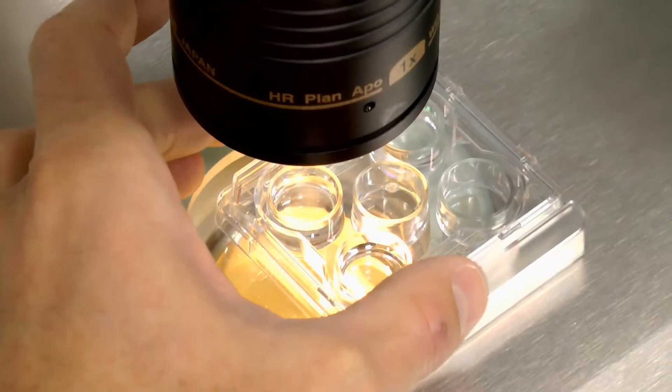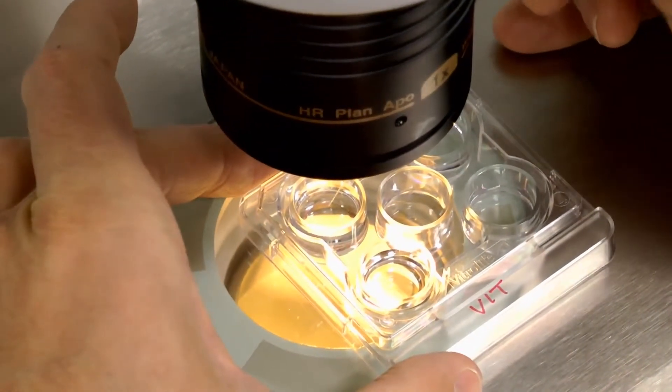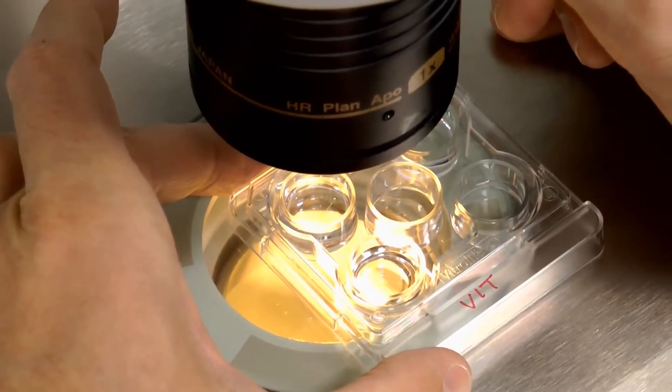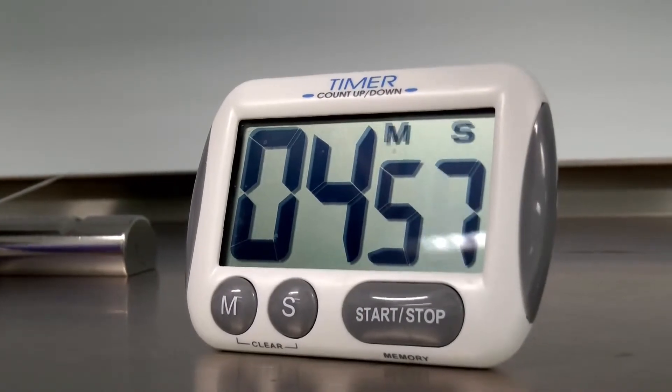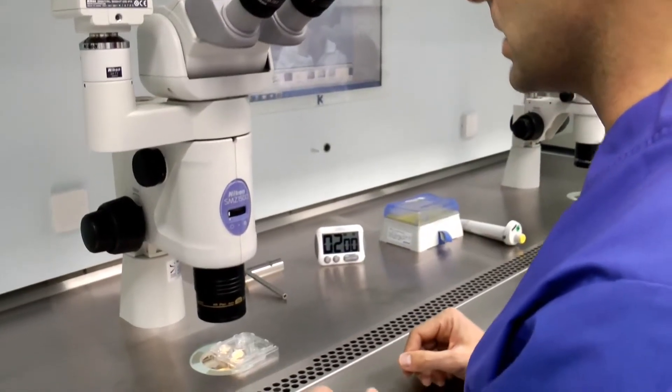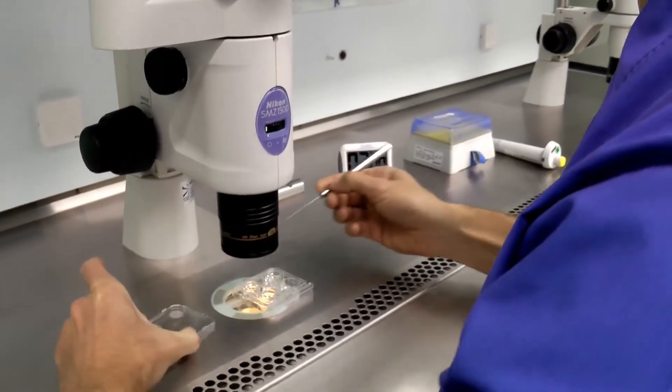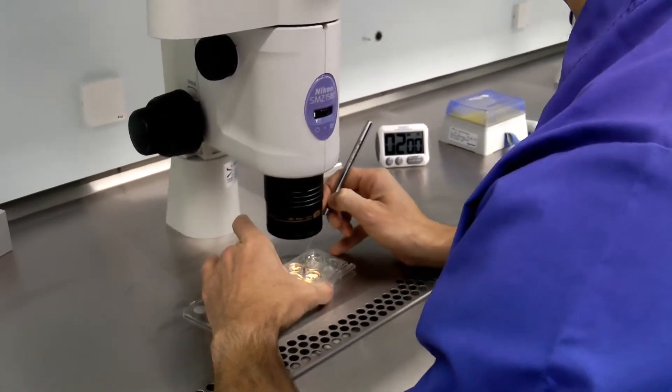During the first step, you take the embryos from your culture dish and move them into the first solution and leave them there for five minutes. During the second step, the embryos are moved from the first solution to the second solution and remain in the second solution for two minutes.